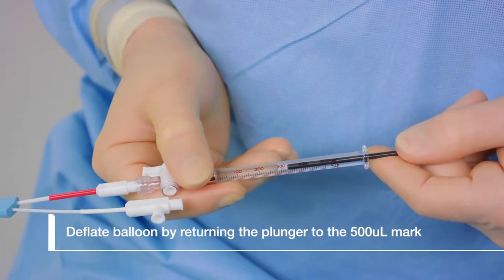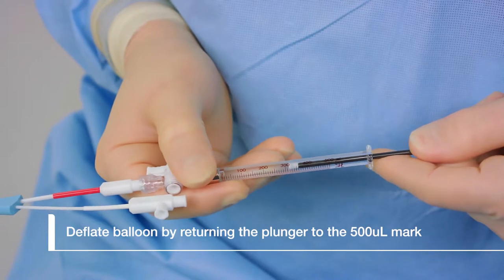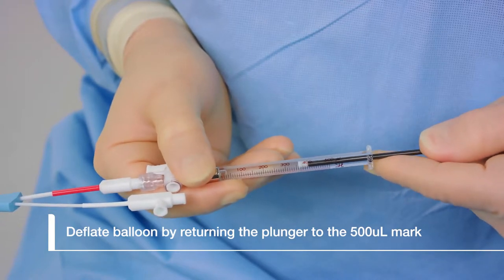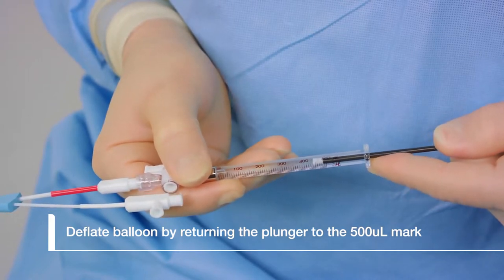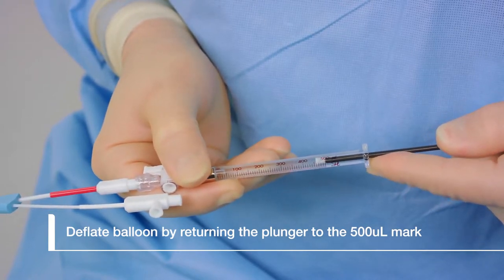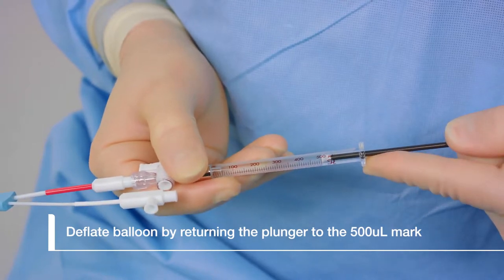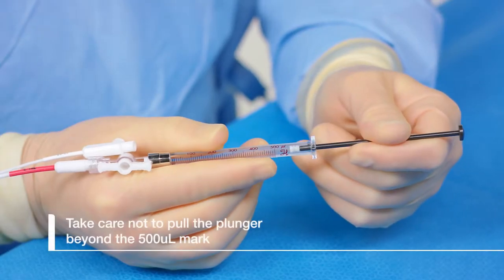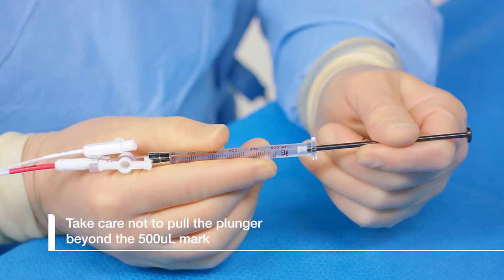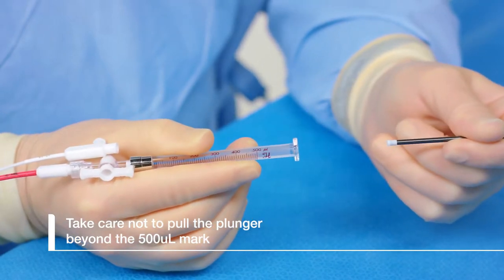Before retracting the balloon inside the bronchoscope, fully deflate the balloon by returning the plunger to the 500 microliter mark. Take care not to pull the plunger beyond the 500 microliter mark.